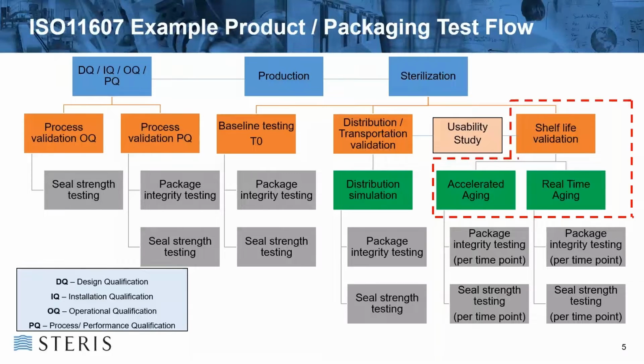So you do, say, your IQ or your OQ, and you'll do seal strength testing, establishing what your seal strengths are. For your process validation, you then do package integrity testing and seal strength, so you know that your process is not going to cause any issues with the packaging, that the seal strength is still valid, and that you have a good range in there. Then you have your baseline or T0 testing from your production samples, which have also gone through a sterilization process. The sterilization process is a whole process by itself with a lot in it, which we're not going to look at today.